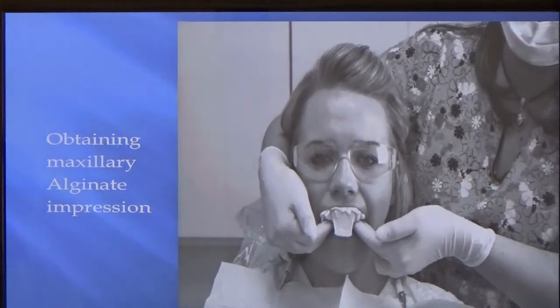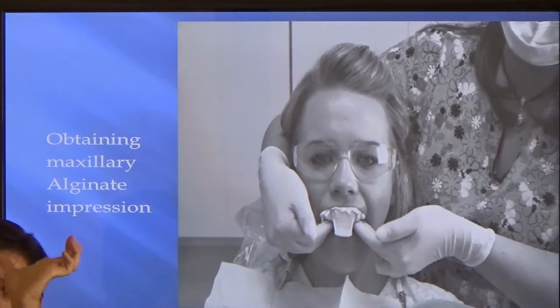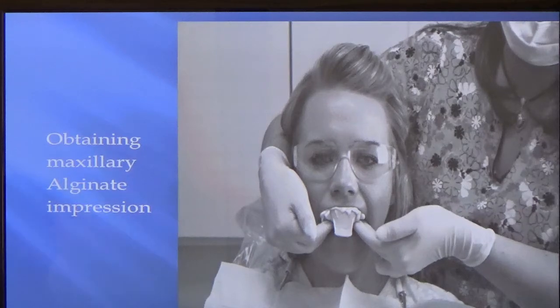Okay, so again, once you put it in the mouth, you want to hold it. You put it in the mouth and just hold it. You don't want to put pressure. Once you seat it, just put light support on it. Don't keep pressing up. Just support it.